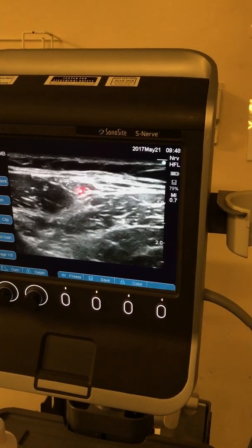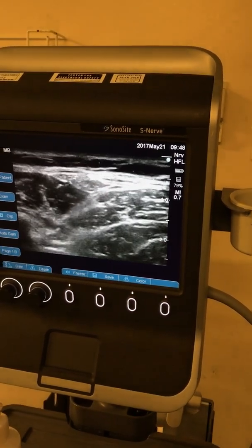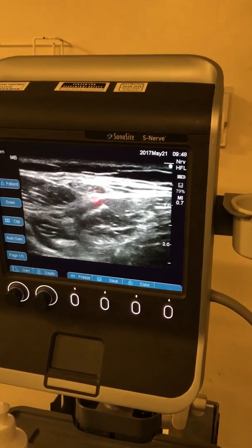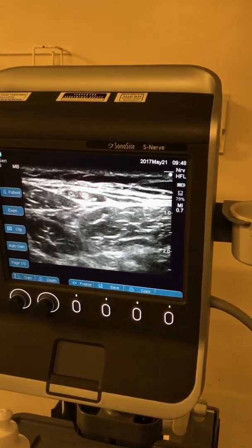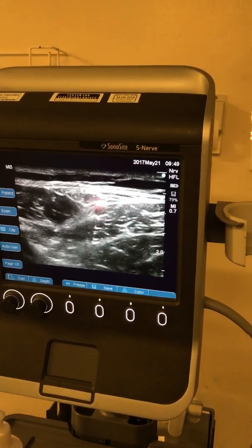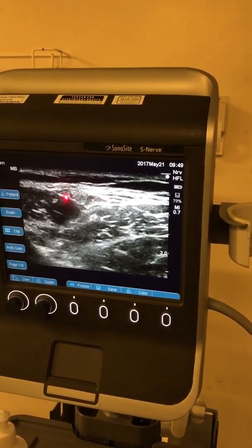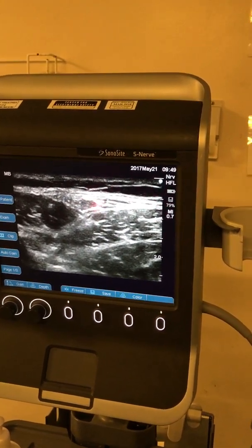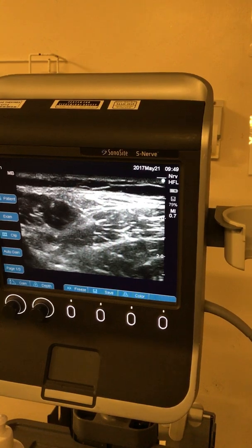Now I can scan the nerve up, and you can see it looking much more clearly, closer and on top of the sartorius. That's a point of optimal visualisation — which may not be the point of optimal blockade. So if I have to block it, I'll just go more up, and I can see there's a triangular fat-filled place where I can put the needle lateral to medial and fill that area with local anesthetic.